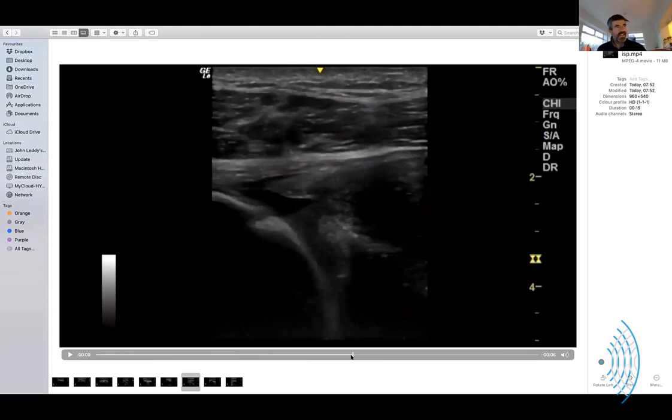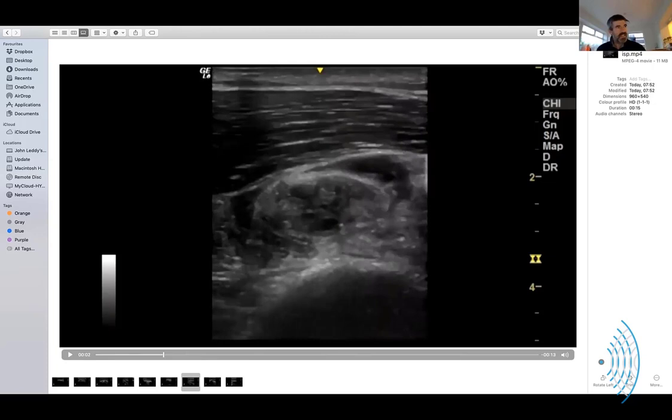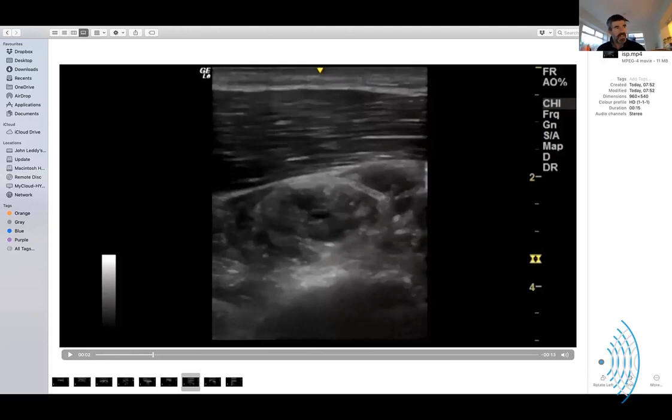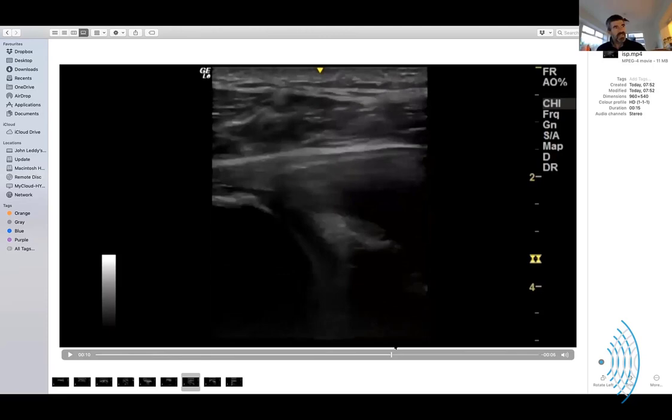There's his infraspinatus. Oh, wow. That's beautifully bad. Yeah, beautifully bad. I like it. He was not an easy scan, but this is his infraspinatus tendon, intramuscular portion of the tendon, where you can see that it's retracted and almost made its own little environment there. Yeah. A little defect inside it as well. So some of it is still attached, as you can see, because it gets dragged around.